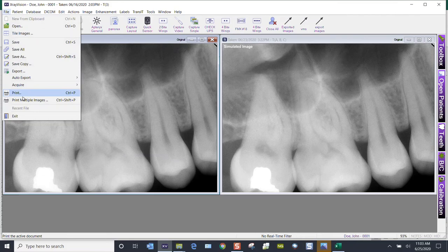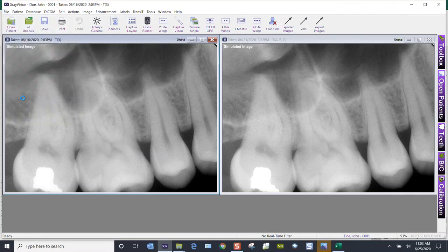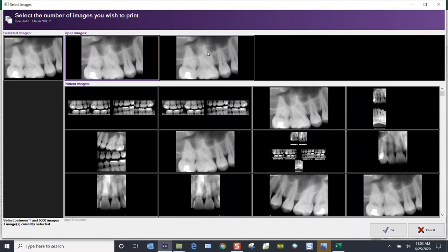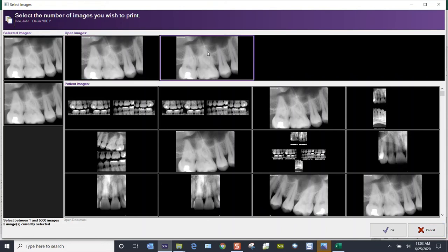Go to File, Print Multiple. The next screen shows your open images, your patient images, and selected images. We've opened those two images, so I would select them both.